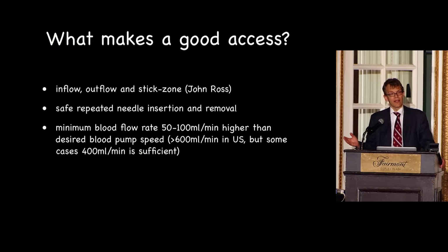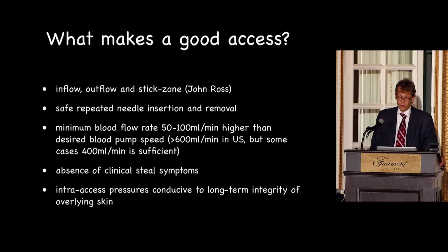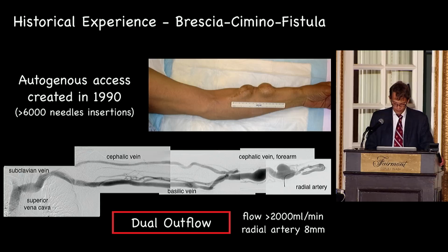The blood flow rate needs to be higher than the blood pump speed that you use in your setting. In the US, that may be 500 blood pump speed in some scenarios, while if you go to China, a lot of people dialyze with 250 ml per minute. And so you can do with lower blood flows. You do longer dialysis treatment times. So this is a relative statement. You don't want to have steal, and you want to have intra-access pressures, and we come back to that, that are conducive to long-term integrity of the skin.